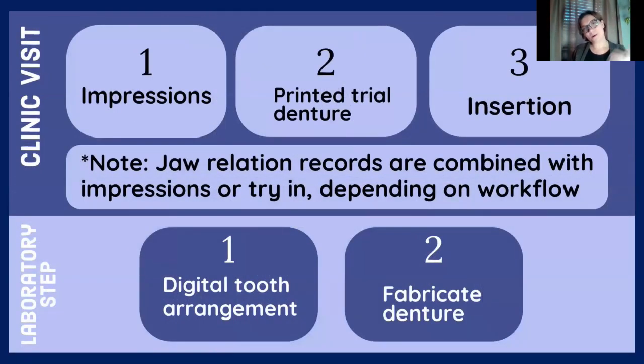And to show, compare and contrast the difference with a digital denture workflow, this is what we're looking at. It looks a lot smaller, a lot more condensed, but the most important takeaway here is that we're not eliminating anything. We're not eliminating interocclusal records, we're not eliminating impressions. We are still doing all these steps, we're just combining and consolidating them in a way that makes it easier to bring into your practice.